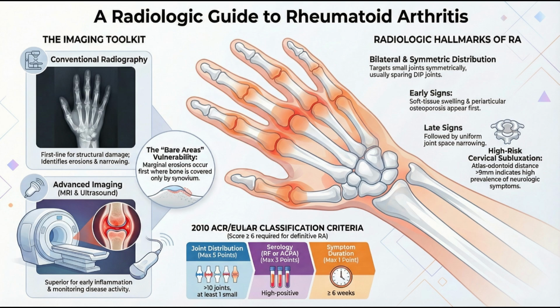Okay. A smart radiologist will x-ray the feet. The feet? Specifically the 5th MTP joint, the base of the little toe. For some reason, erosions often appear there first. The feet can be the canary in the coal mine for RA. That is wild. So my hand hurts, but my toe holds the proof.